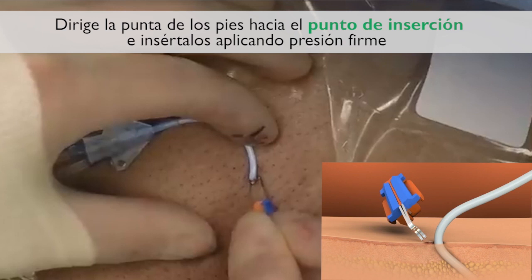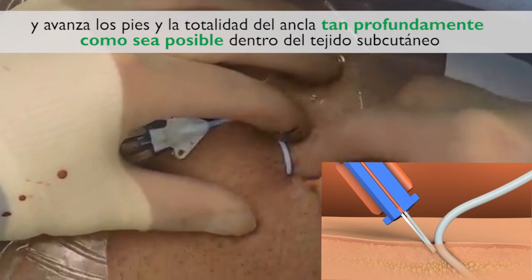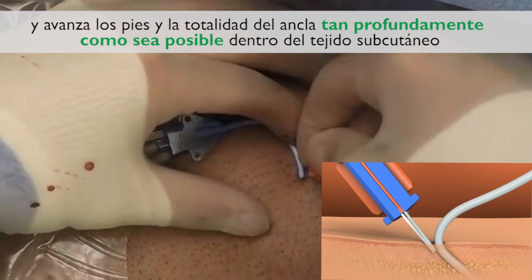Aim the tips of the feet toward the insertion site, insert the feet using firm pressure, and advance the feet and legs as far as possible into the subcutaneous tissue.